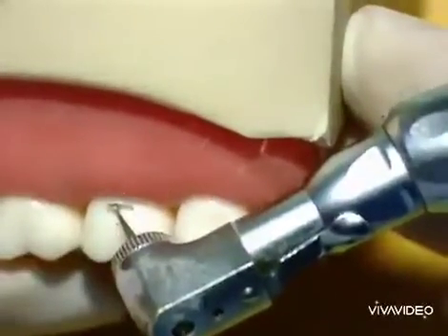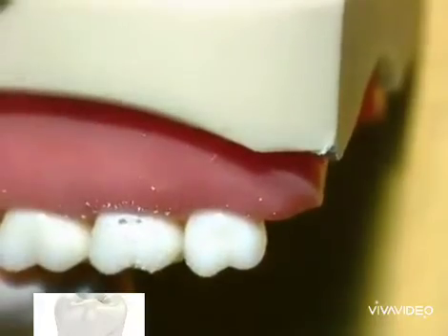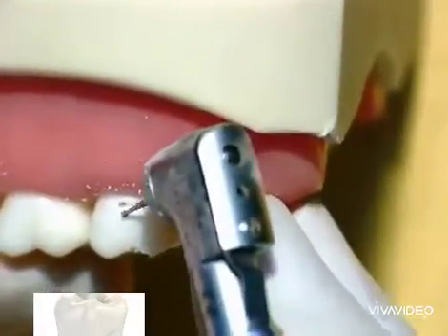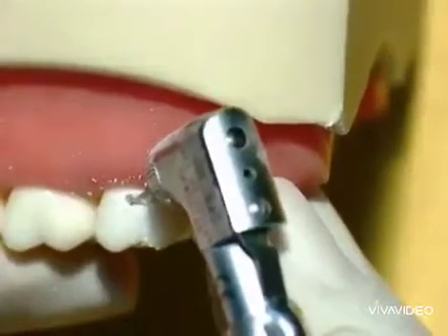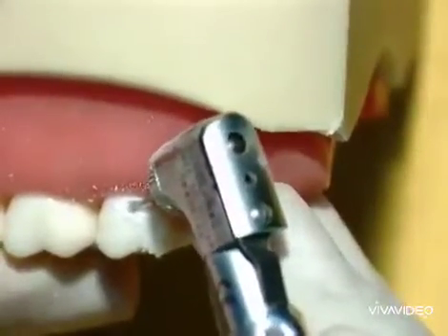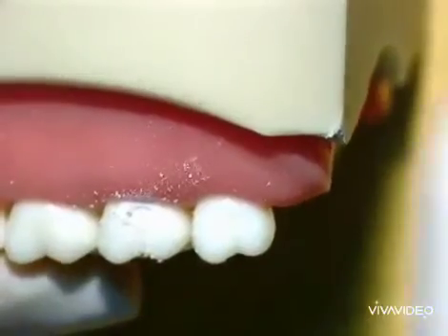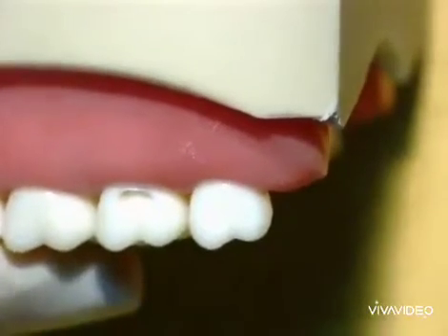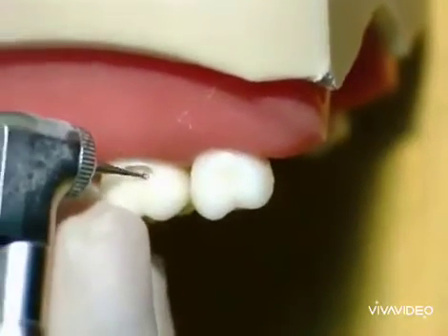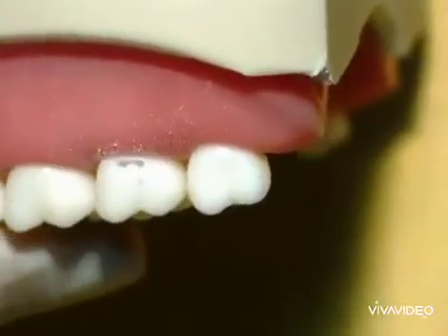Retentive holes are made using a very small round bur at the axial-gingival and axial-occlusal line angles. The depth of the retentive holes is 0.5 mm, in dentin.